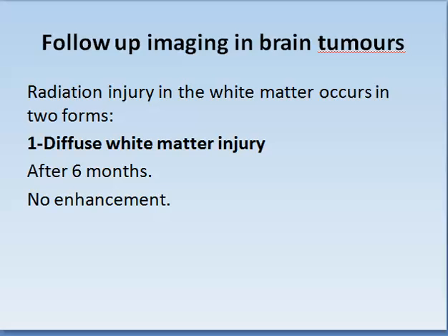Follow-up imaging in brain tumors. We have two main problems in brain tumors. Number one, it should be done early, within the first 3 days, to see if there is something enhancing. It would be residual, or you will be falling in a dilemma between being an enhancing residual or being enhancing granulation if you are doing your contrast study after 4 days.